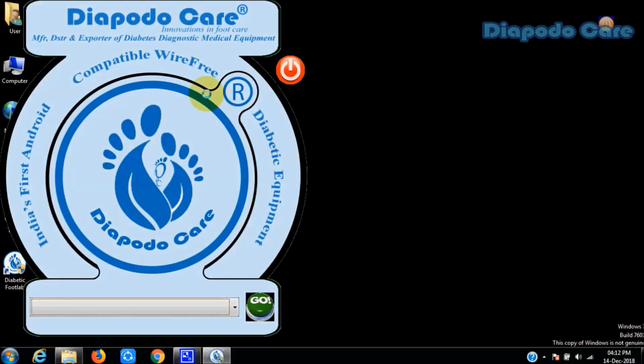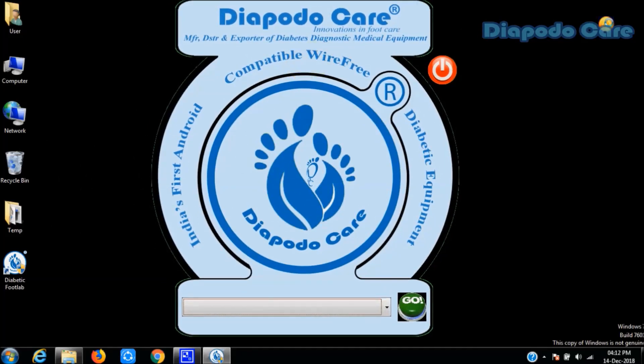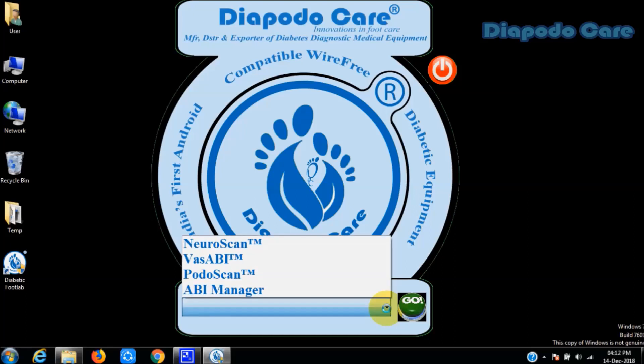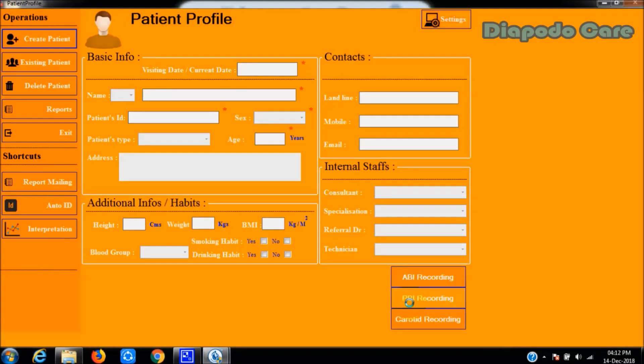First, open the Diabetic Foot Lab software. You will see the main page view of the Diabetic Foot Lab software. Select the Vassabi option from the given list of programs, then click the Go button. You will then see the patient profile window of the Vassabi software. Click the Settings button visible in the top right corner of the page.